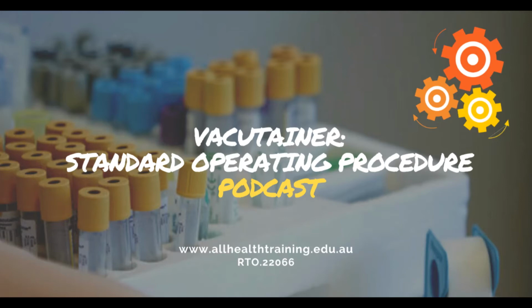Pick up the barrel in your dominant hand using a pistol grip. 2 fingers behind the barrel and your thumb on top. The rest of your fingers should be tucked away, or if they fit onto the rest of the barrel, you can keep them there. Return to your patient standing directly in line with the vein. Uncap the needle and drop the lid into your kidney dish.